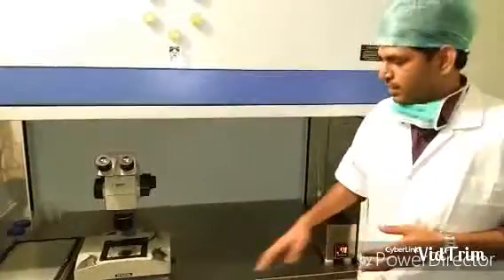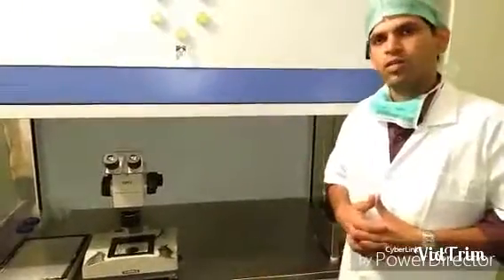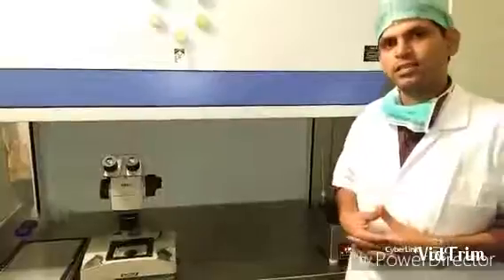We usually clean the surface with a disinfectant and then switch on the ultraviolet light for about 15 minutes before we start our procedures in the morning.